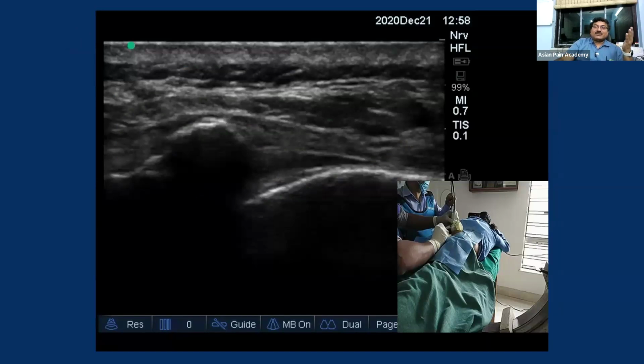But when it comes to fluoroscopy, for initially putting the needle in from the central line and maintaining the angle, you might have to change the direction, AP and lateral, multiple times. It's not difficult, but it is more cumbersome compared to ultrasound. So in this part, going to the sacrococcygeal ligament, ultrasound is super. But when it comes to going inside, here the ultrasound does not remain as good as fluoroscopy.